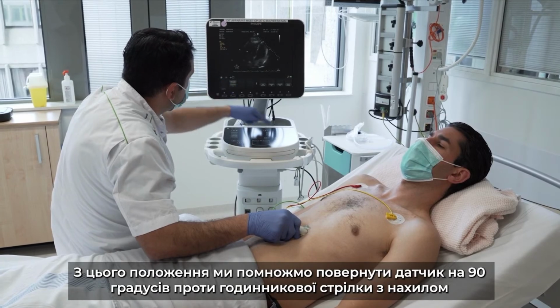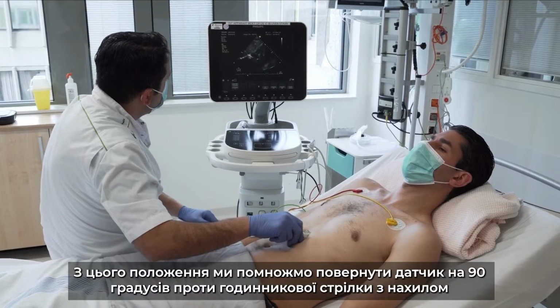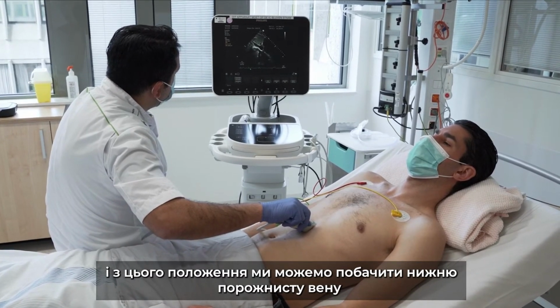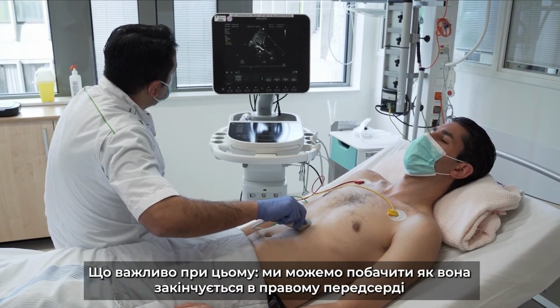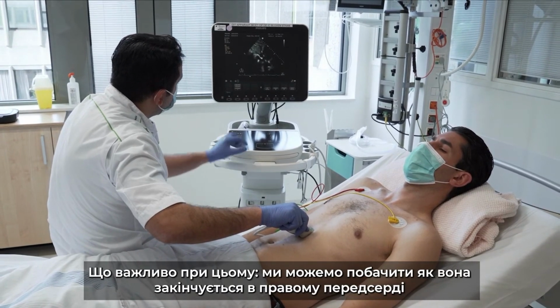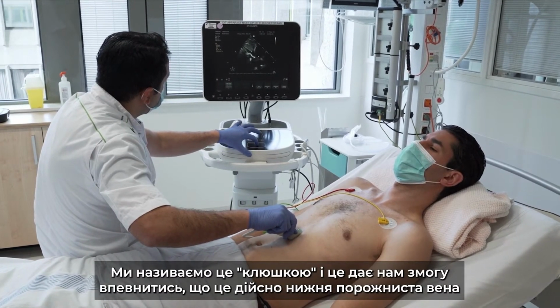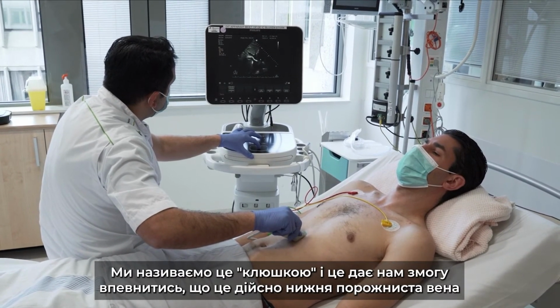From this view, we can rotate the probe 90 degrees anti-clockwise with a slight tilt, and with this view we can see the vena cava inferior. And what is very important with this view is that you see it ending in the right atrium. We call it a golf stick. That is your assurance that it is indeed the vena cava inferior.